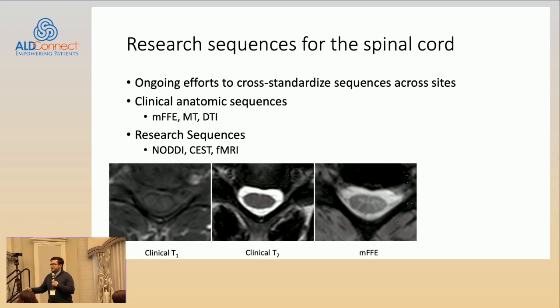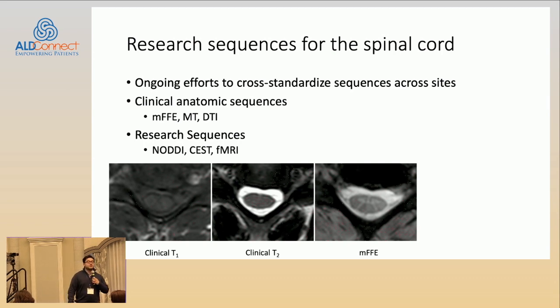For research purposes, this is extremely difficult if we're talking about atrophy. Because if you think about atrophy, what does that mean? Does that mean the white matter is reduced? Well, we expect that, knowing the pathology, but can we show that? Can we quantify that as well? And without this discrimination, that's extraordinarily difficult. So this new sequence, the MFFE, will allow this.